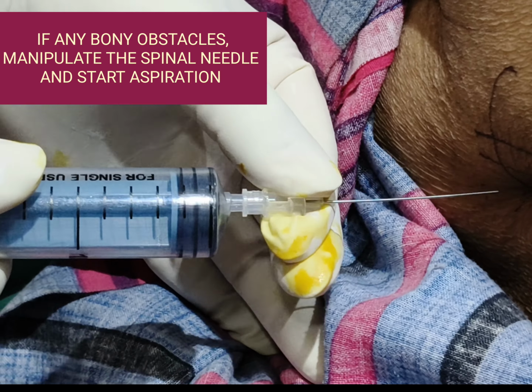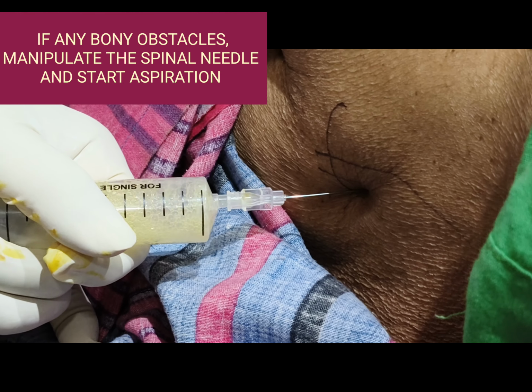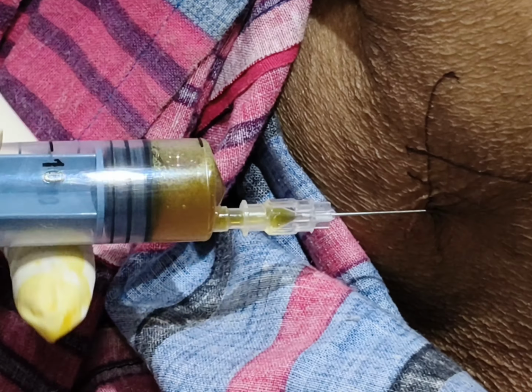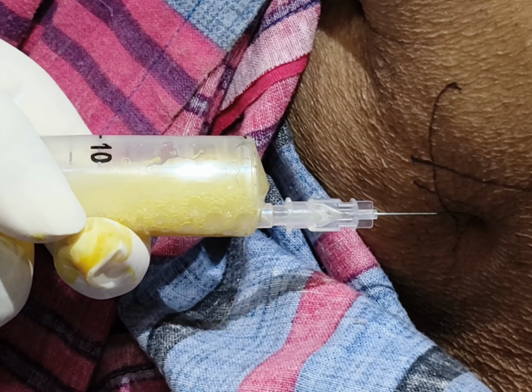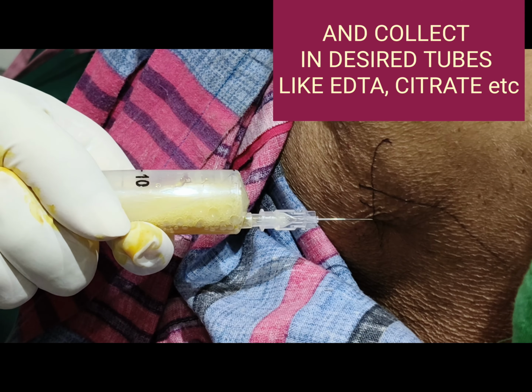Now we can aspirate the fluid first. We have to aspirate the fluid before doing biopsies, because if we aspirate the fluid after biopsy, it can contain hemorrhagic material or blood. In that case, the color will be red.